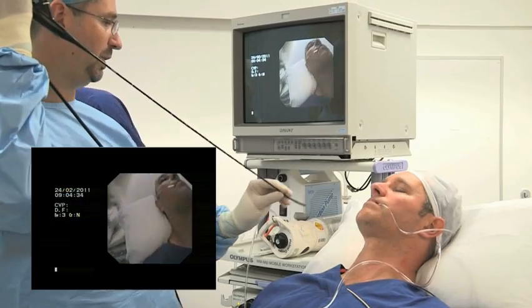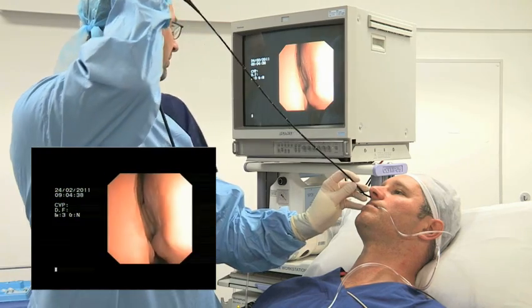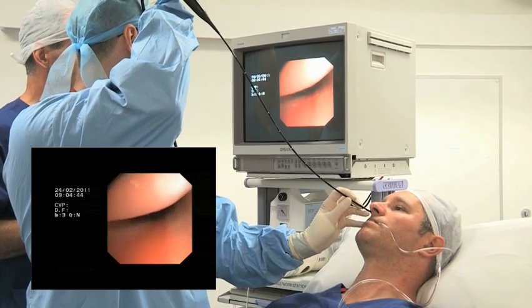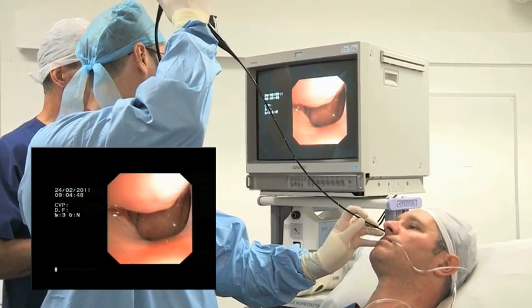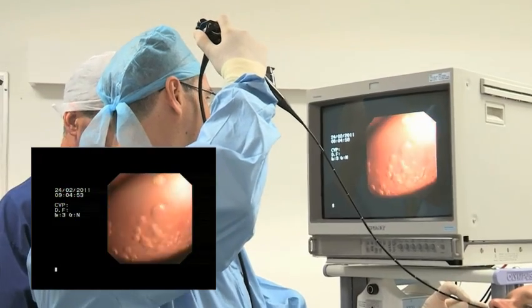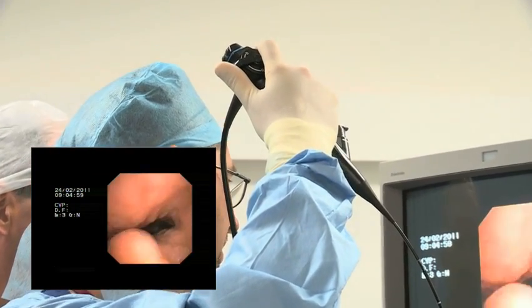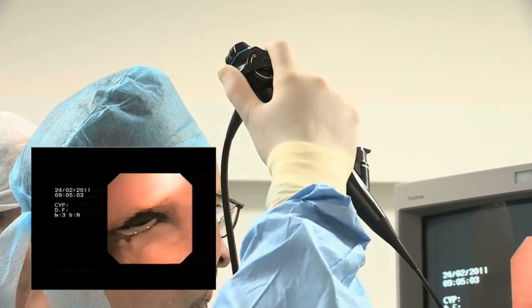Insert the nasal endoscope into the favoured nostril and advance along the nasal floor. Note that the endotracheal tube should be loaded on the fibroscope at this point. It was omitted in this demonstration video as the subject was only topicalised and not intubated. Once through the nose, direct the fibroscope tip inferiorly. Advance past the tongue base until the epiglottis is visualised.